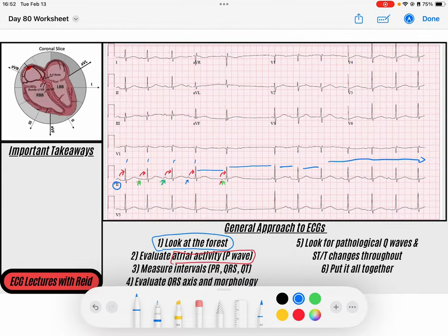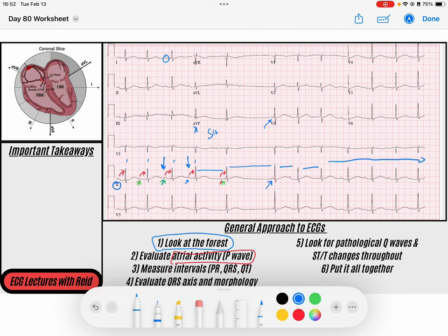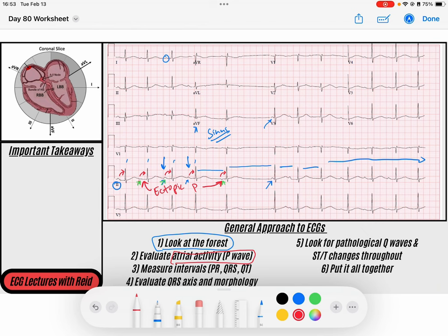Which ones are the sinus P waves? Normally the sinus P waves occur at some regular interval with the same morphology over and over. These P waves here appear to be our sinus P waves — they're upright in lead one and AVF. The ectopic P waves are likely there and there. We know these are ectopics because the P wave morphology is different, telling us the P wave is being conducted from a different location within the myocardium of the atria.